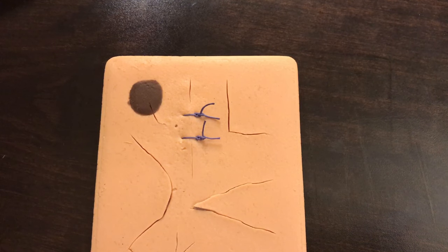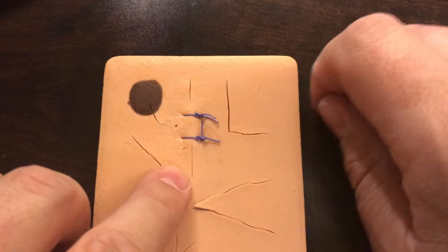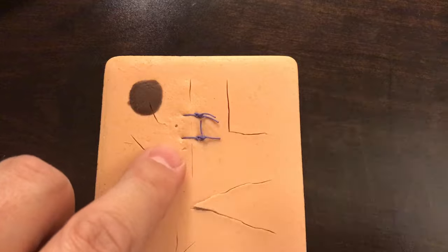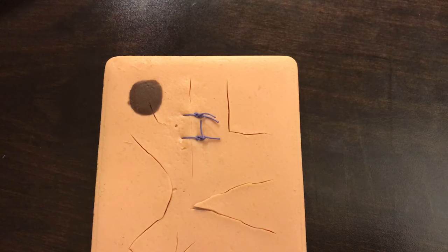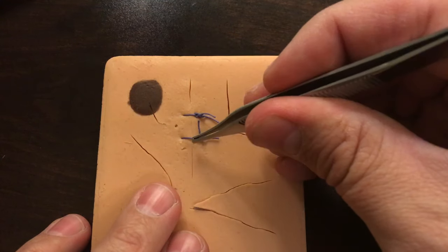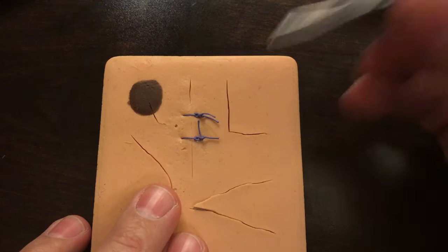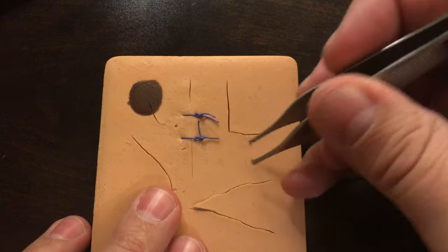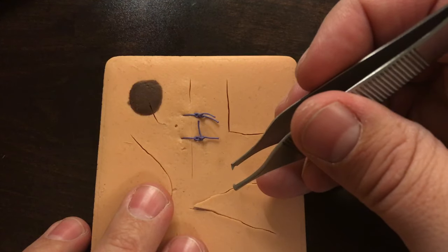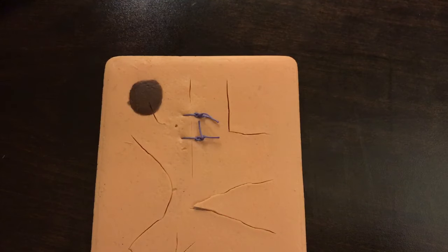We want to make sure that we remove them in a very specific way with best practice. Generally, the idea is we don't want to just cut the suture right in the middle and pull it out, because if we cut in a way that the part of the suture that is out on the skin is then dragged underneath the skin and through the tissue before it's pulled out, it's going to be seeding and tracking bacteria all along the way and puts the person at increased risk of infection.